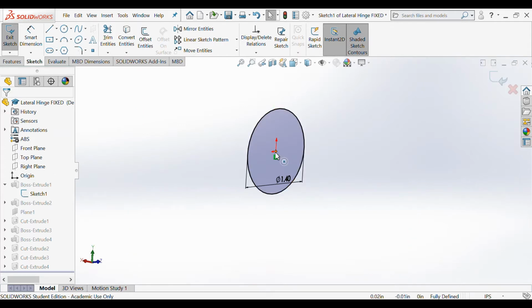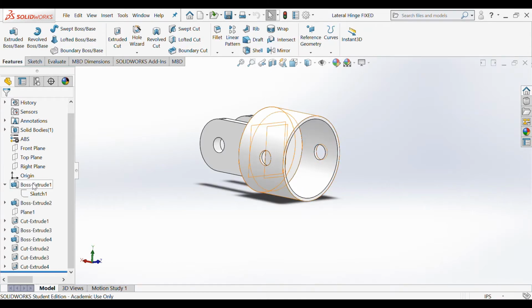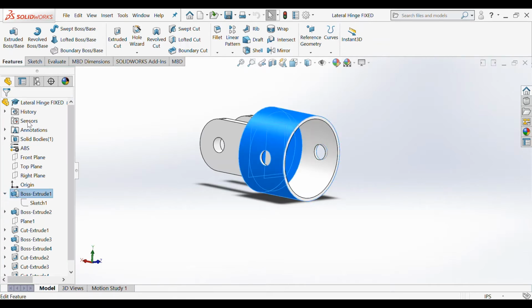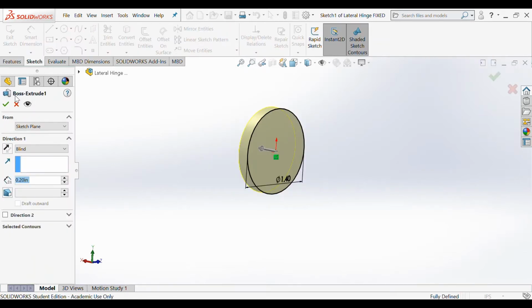We're going to draw a center circle out from the origin, and we're going to choose its diameter to be 1.4 inches. Next, what we did was we boss extruded that circle. So we went to boss extrude, and we made it to be a thickness of 0.2 inches, and we did a blind extrusion backwards.